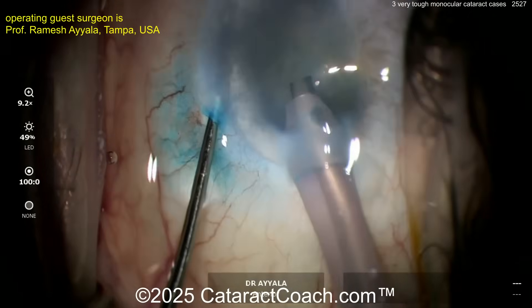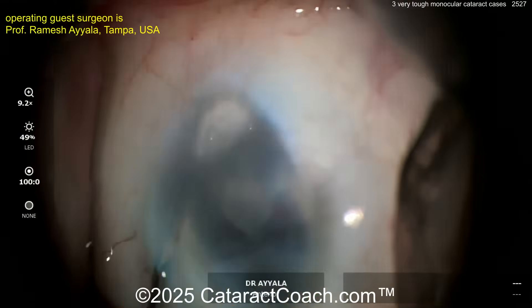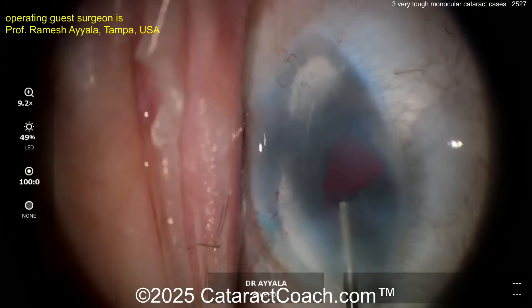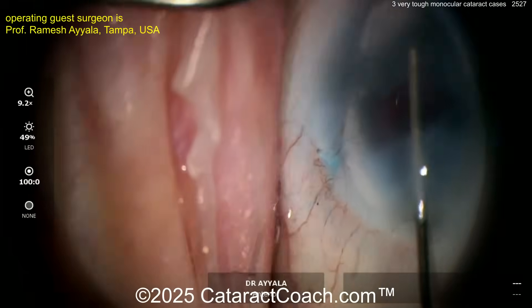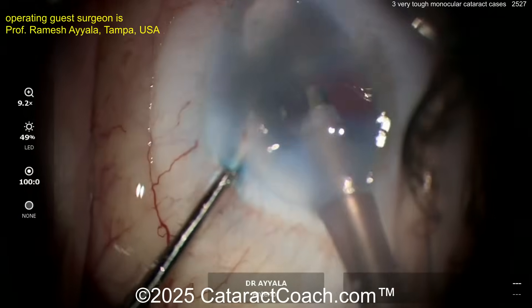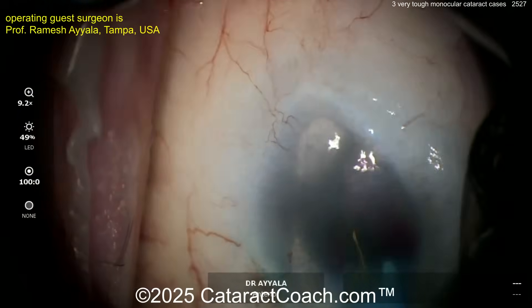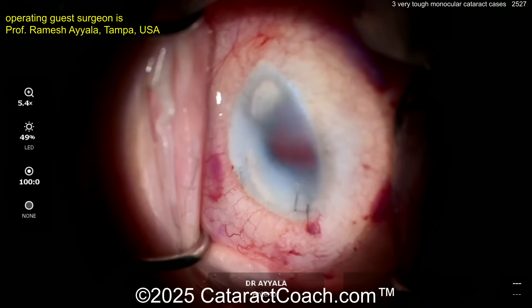Using the phaco probe, hopefully just debulking the nucleus there a bit. Maybe a groove down the middle to debulk it more. The window of view for the surgeon is just so limited — there's so little cornea to look through, plus the corneal haze and the pre-existing corneal scar. There's finally a red reflex. Now figuring out if there's lens cortex to aspirate, and doing some viscodissection to remove the rest of that epinuclear shell. I like the use of a lot of viscoelastic here — it's definitely a friend. Here comes a single-piece acrylic lens going into the capsular bag — look how mega-sized that IOL looks inside the eye. Removing viscoelastic and finally finishing up the case.